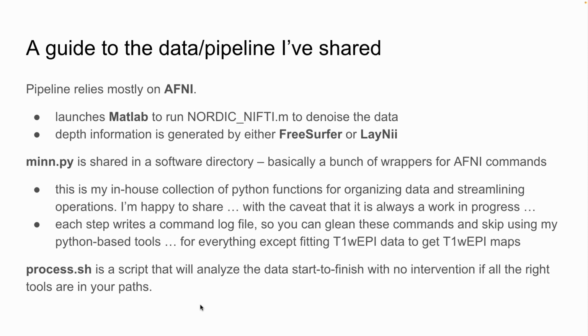Your physiological noise is still there, it's still a problem, but your biggest noise source is now just thermal noise, random independent fluctuations in the electronics that you're using in your hardware. And key to that idea is that it's independent. And so if you analyze the structure of the data, you can find components that look independent. I have no idea how the algorithm does it. Other people can teach you Nordic, not me. And that's what Steen did when he wrote this Nordic algorithm. So it takes your data and it looks at the noise structure, identifies the part that is independent and explained by nothing else in the data, and then strips it out.